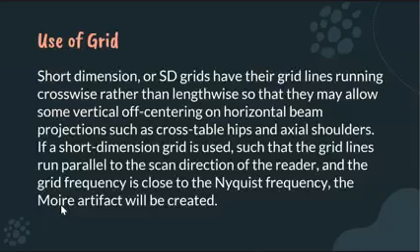I don't know how to pronounce it, but I think it's Moiré. The Moiré artifact is a false presentation of diagonal lines caused when two grids of lines with similar frequencies overlap. The Moiré artifact still happens in film screen systems, where two types of grids are overlapped with each other. When that happens, it will produce the Moiré artifact.